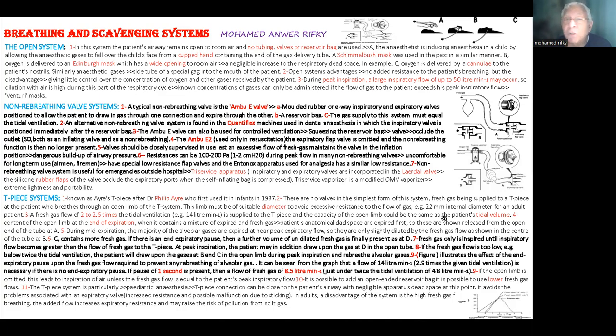So this figure, I will show it later on, represents the tidal volume and the stages of inspiration in seconds. And this is the process of inspiration, expiration, and these are the two minute volume rates, as you can see, showing that whenever we have a pause, there is enough time for all the expiration to be expelled, so that the patient will not rebreathe the previous expiration. So these are the advantages of the T-piece.